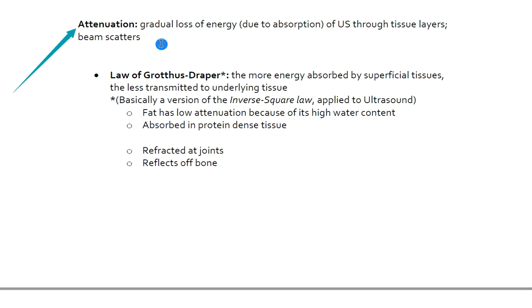And you could think, if you put sheet metal up on certain walls, what would that do to sound? Well, that would cause the sound to bounce off there more, and it would actually increase the sound because you'd get the reflection of the sound. So some tissues cause more reflection of the sound, and some tissues cause more absorption of the sound. And a lot of this has to do with the structures. Are they joints?